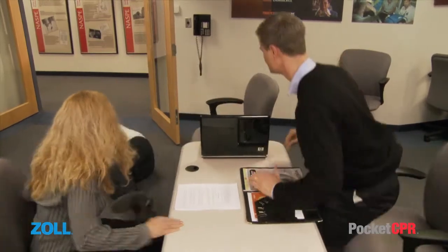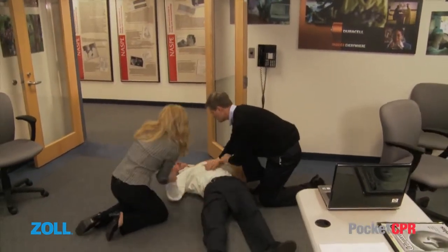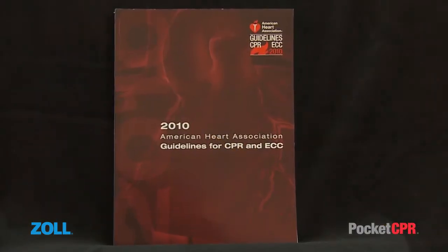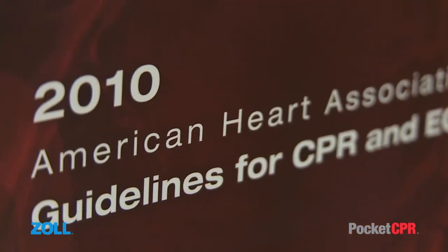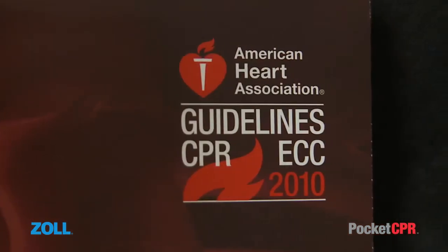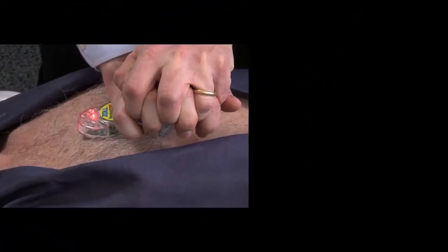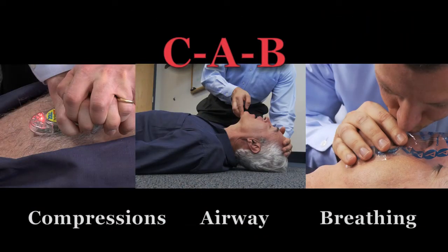It is intended for use on patients over the age of 8 who are unconscious and not breathing normally. The latest CPR guidelines, published on October 18, 2010, offer new recommendations for CPR, including that rescuers begin each resuscitation with 30 chest compressions and follow the C, A, B, or compressions, airway, breathing method.